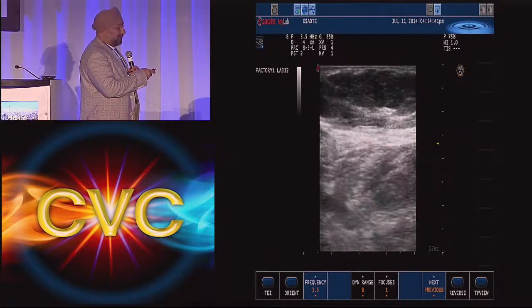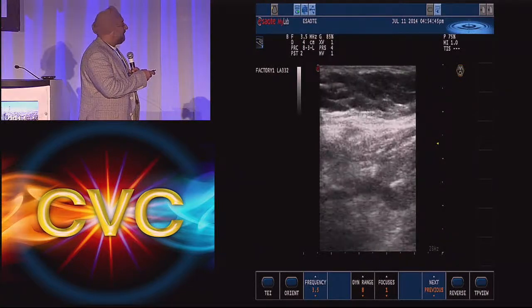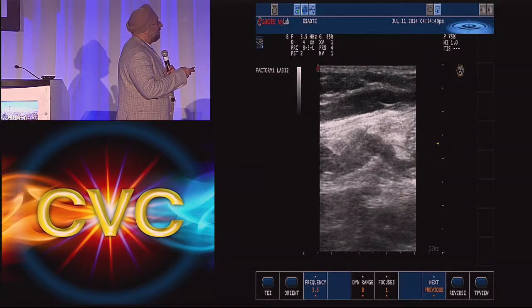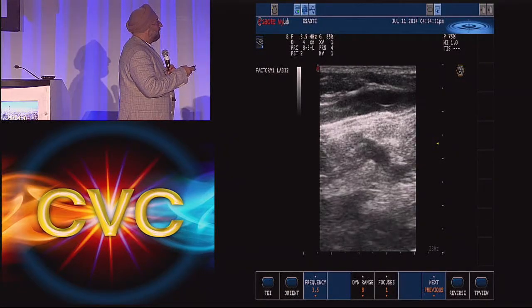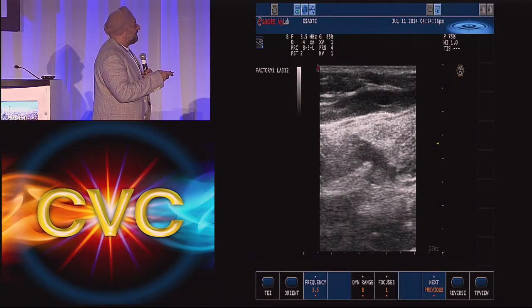Then she went longitudinal. She's following that up. How far up are you there? She's right at the popliteal junction. At this point, normal anatomy would be where that would dive in and touch the popliteal. In this case, it's not doing that.